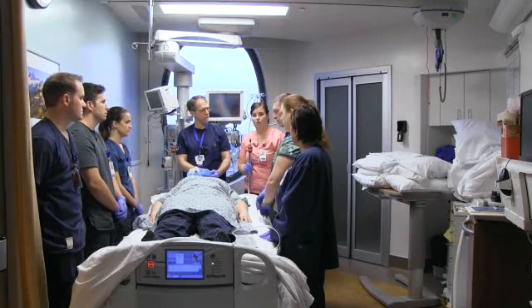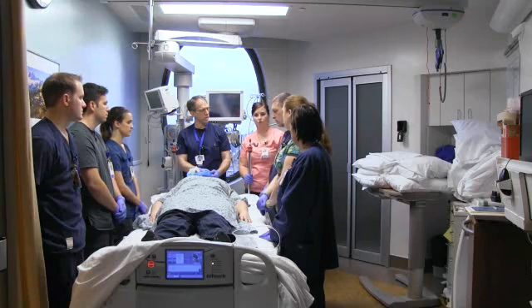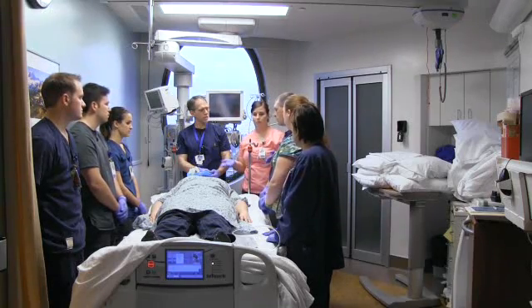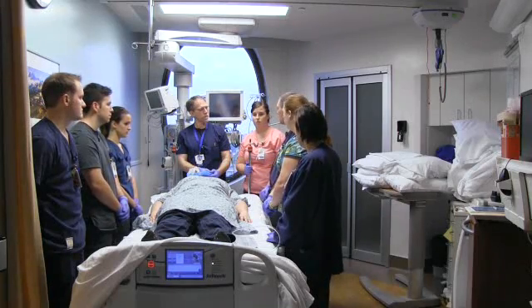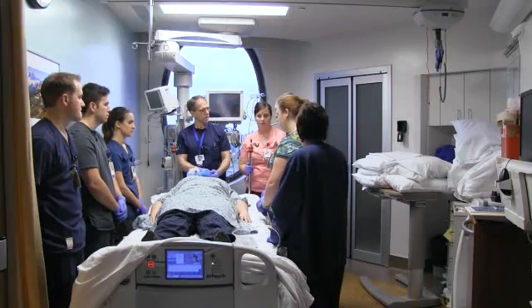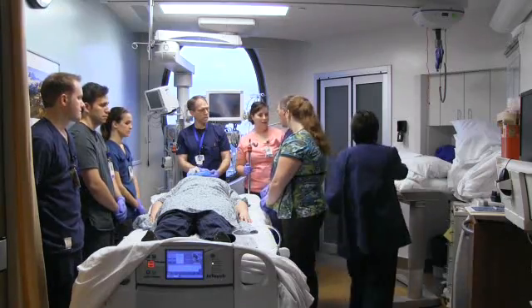Once all of those things are in place, then you're ready to gather the team and move. You have to have RT at the head of the bed and then three people on each side. Make sure you've got a point person, which is usually the primary nurse. The first step is going to be to cover the patient in a flat sheet.